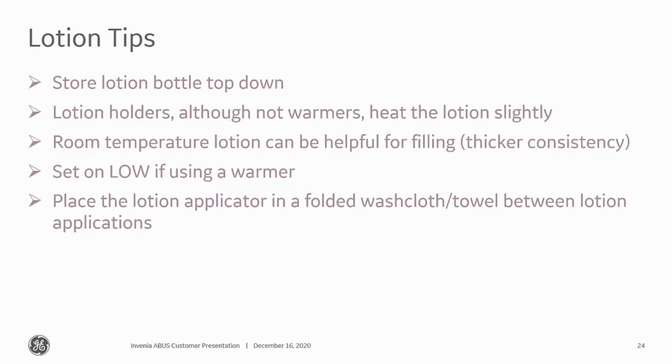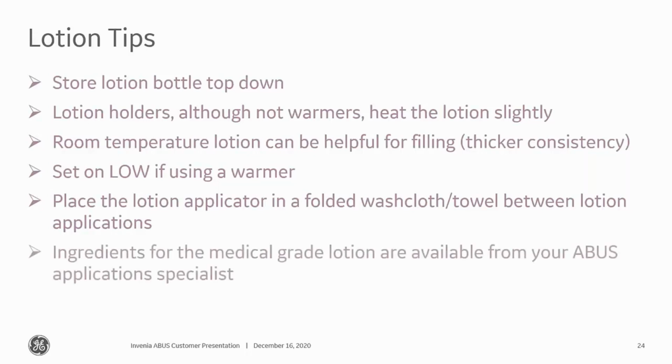And as far as keeping it in a spot, I highly recommend keeping a jar or some tray or something close by the machine, so that you can always know where that lotion applicator is. I get a lot of customers telling me that they've lost their lotion applicator, and chances are it did get thrown away in the linen. So just maintain a spot where everybody knows where that lotion applicator is. That way you're not losing it.